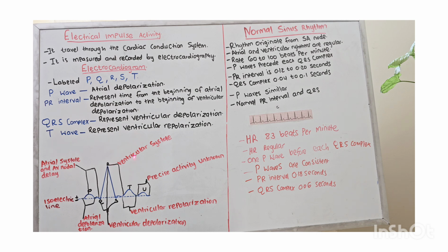Sometimes people confuse depolarization and ventricular repolarization. Remember, D comes first before R, and T is at the end, which is the last repolarization.